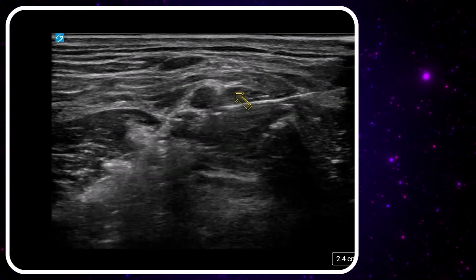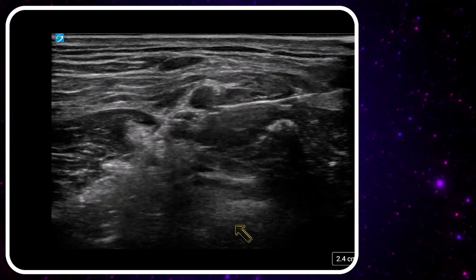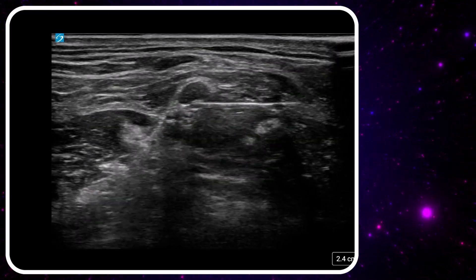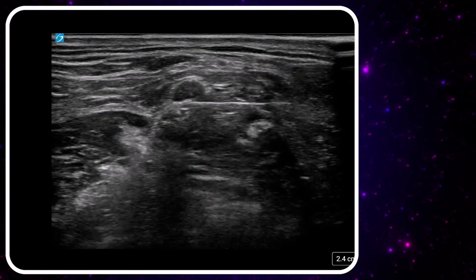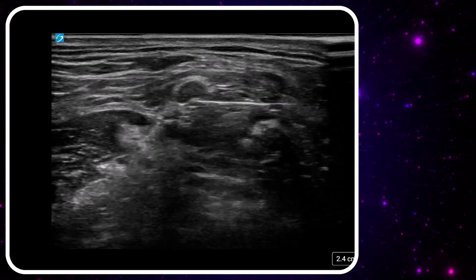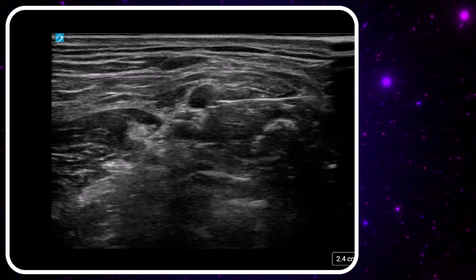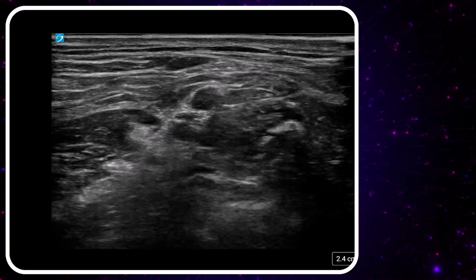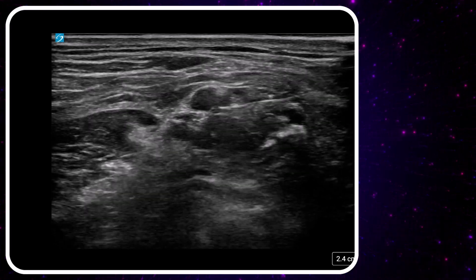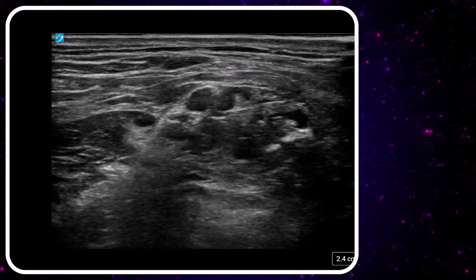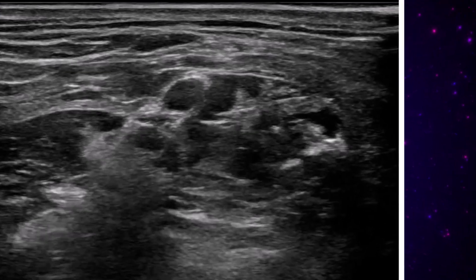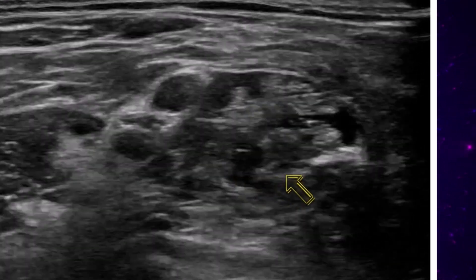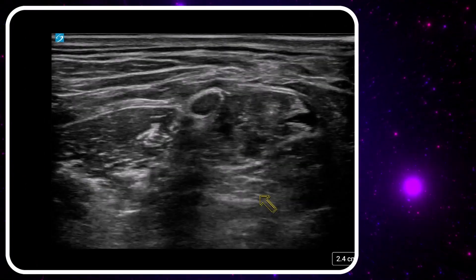We've got a gentle injection here and we can see some local anesthetic spreading there. This patient is completely awake and is able to give us feedback if they get paresthesia, which is not a guarantee for avoiding nerve injury — so caution is the key. There's a bit better spread, but it seems there's some intramuscular local anesthetic deposition happening here.